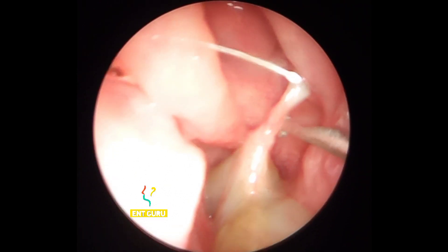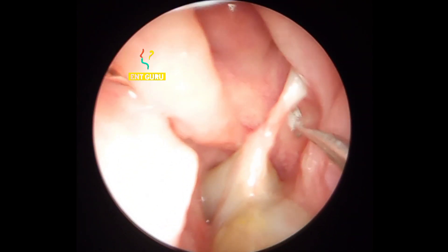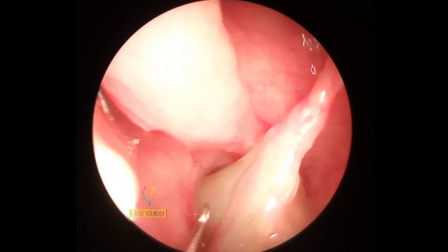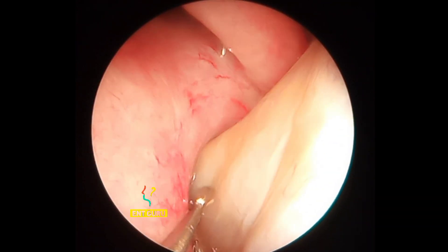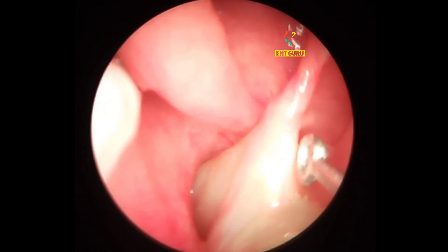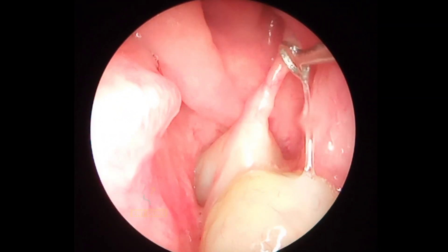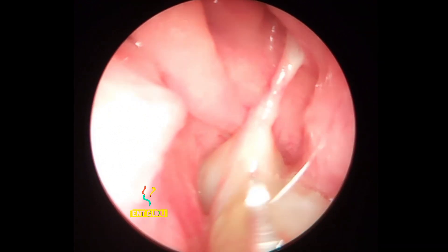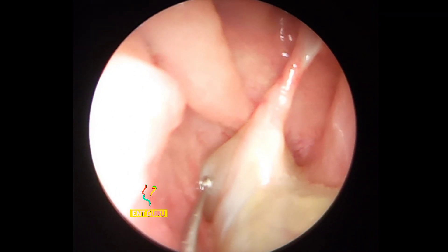Now I want to go back and see how far back it is going. I'm going in the back and I can see that it is prolapsing inside the nasopharynx. Whenever the patient tries to swallow saliva, the mass moves — that helps me, because the turbinates do not move as they are attached. The mass moves; it is attached only by a stalk, as you can see here.